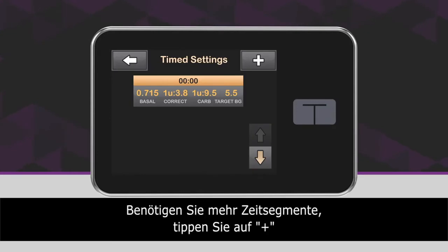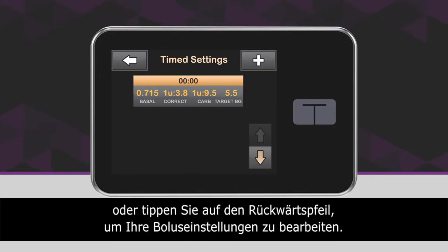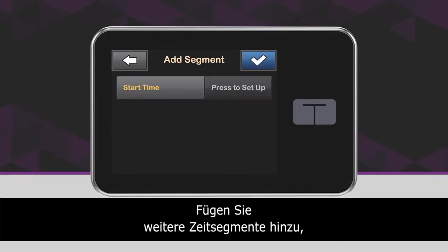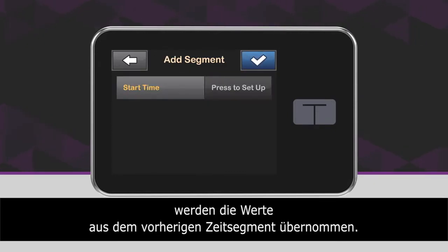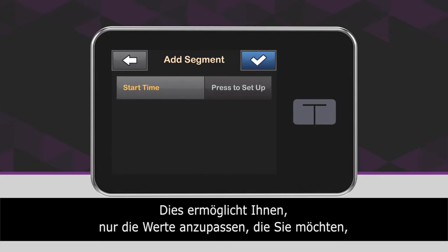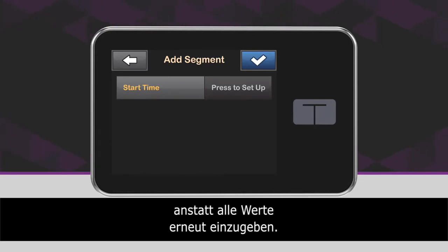If you need to add more time segments, tap the plus icon, or tap the back arrow icon to program your bolus settings. When adding more time segments, any settings that you entered in the previous time segment are copied and appear in the new segment. This allows you to simply adjust only the specific settings you want, rather than having to enter them all over again.